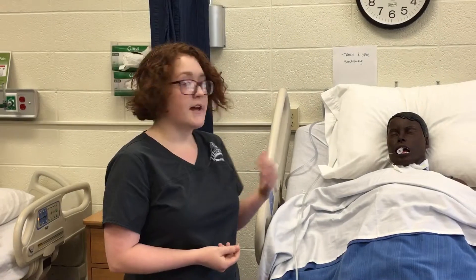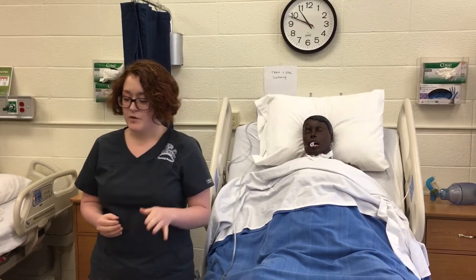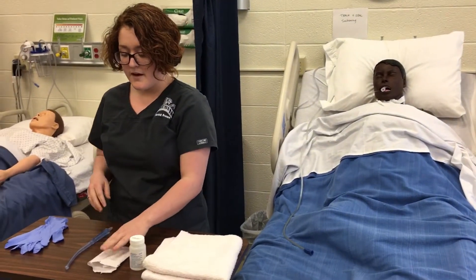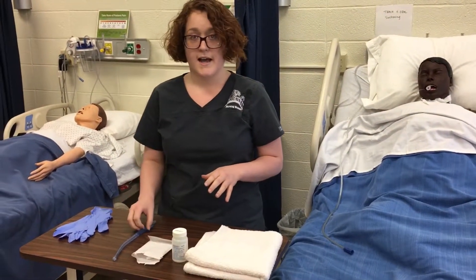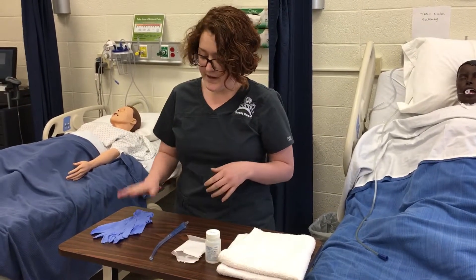First I'm going to go in and assess my client for the need for suctioning. Then I am going to gather my equipment. I have a towel, some lubricant. For my oral suctioning I have a Yankauer, and for my oropharyngeal I have a catheter tip and clean gloves.